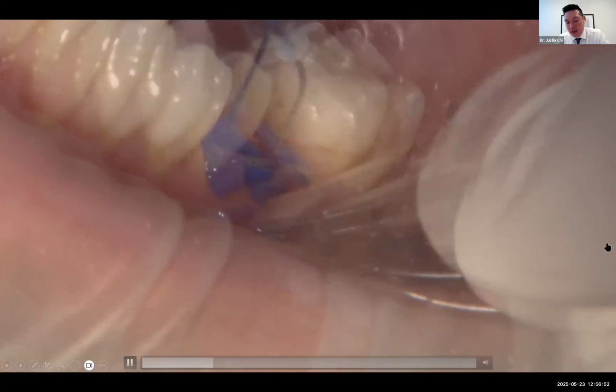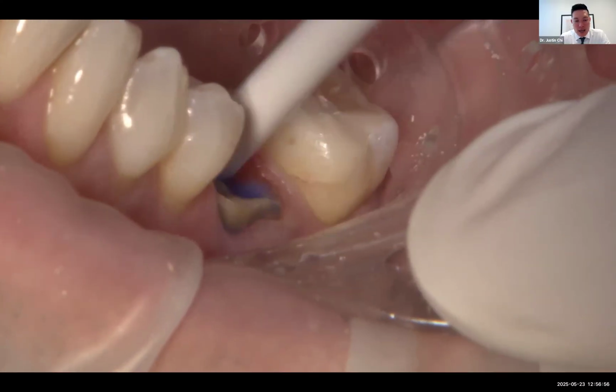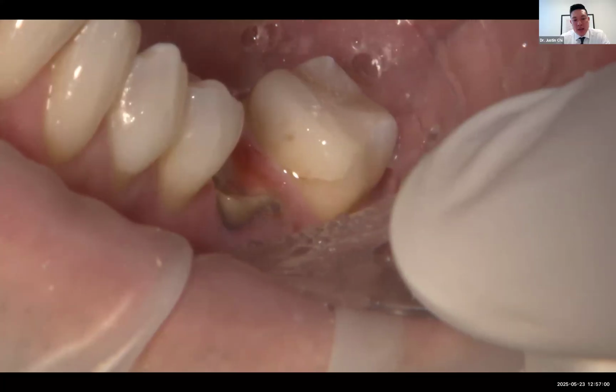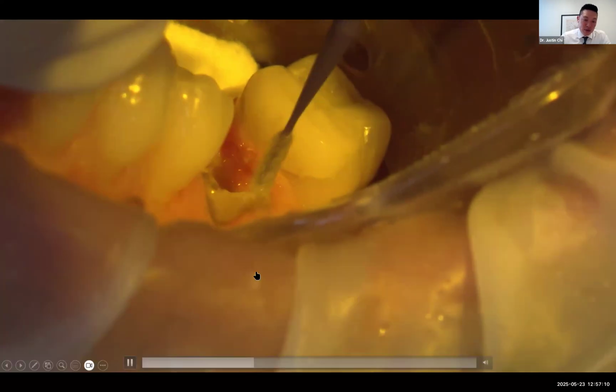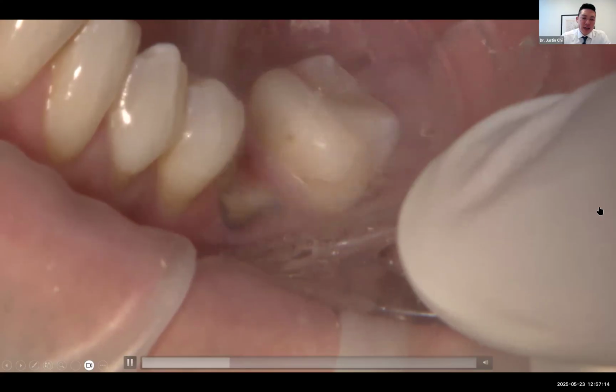So just going back to the tooth side, I like to total etch. I went to USC, studied under Pascal Magnier, big biomimetic guy, bonding guru. Total etch really is shown to provide the best integration and formation of a hybrid layer on etched dentin and enamel surface, as we know. So after we etch, we're going to rinse that off. We want to basically remove the smear layer.